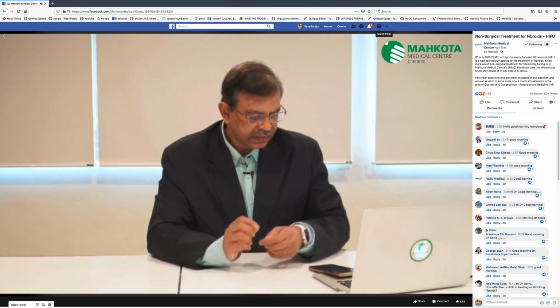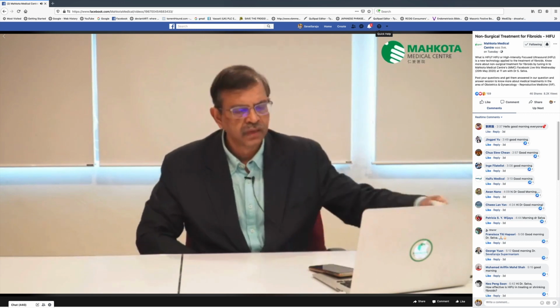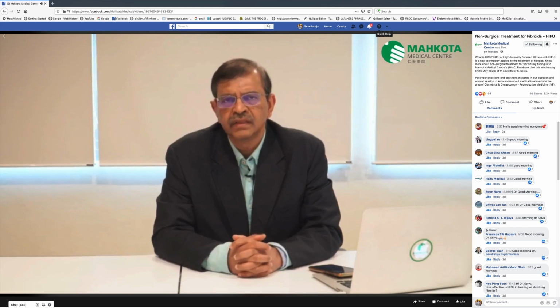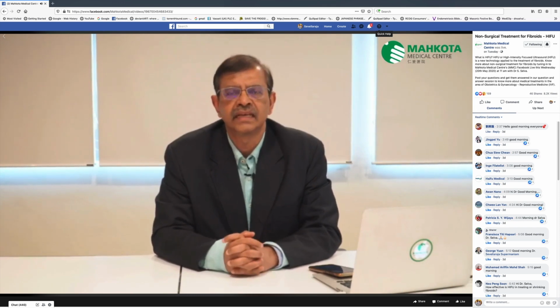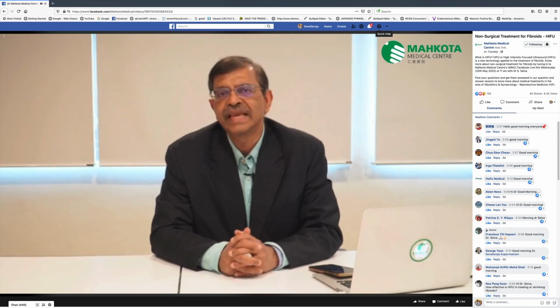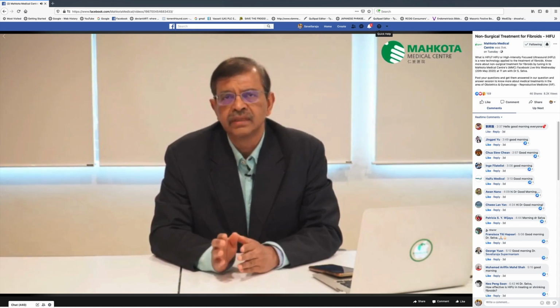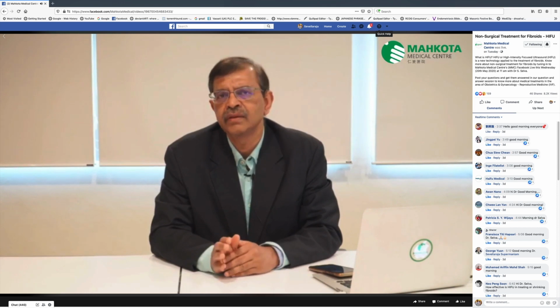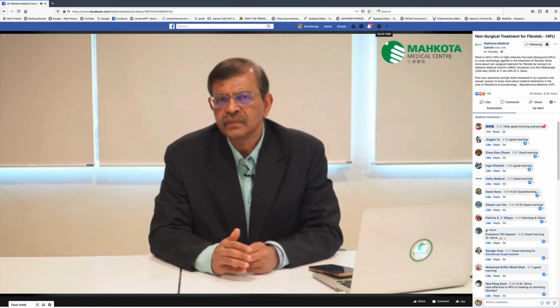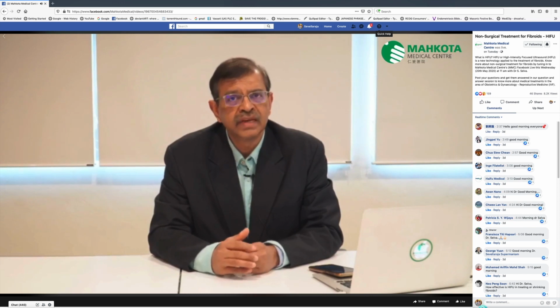Now, the next question is, how effective is HIFU treatment for fibroids? There are many studies that have been performed for fibroids. There are almost, I think, 100,000 cases that have been done with HIFU, and its effectiveness is almost 80%. I'm not saying it is 100% effective, but there's an 80 to almost 90% chance that the fibroid will shrink after the treatment. So it has a very high effective rate, and it has been used in many countries in the world.